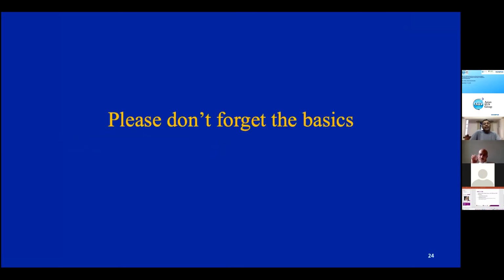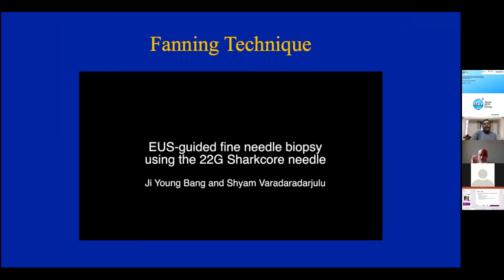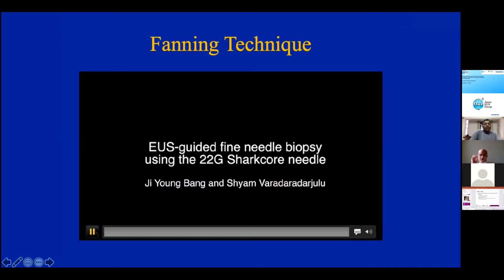But in FNA and FNB, don't forget the basics. Fanning the needle is important. There's no point going back in the same place over and over. Your specimen is going to be bloody. So with these needles, always perform the fanning technique.